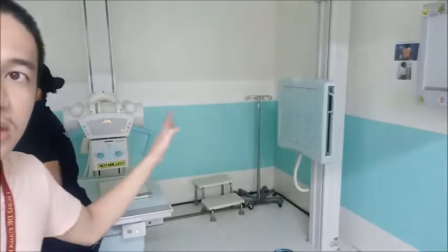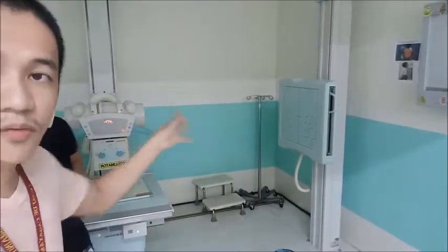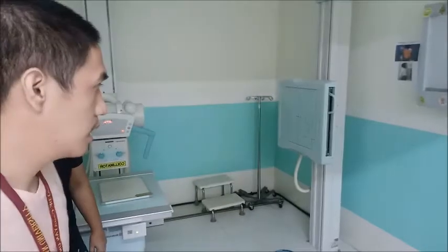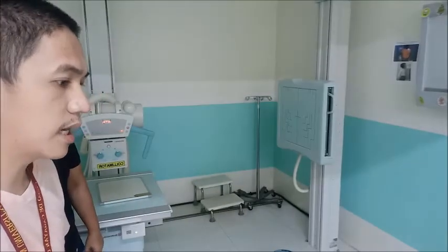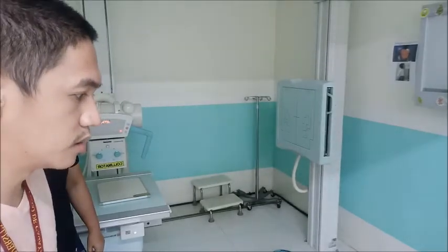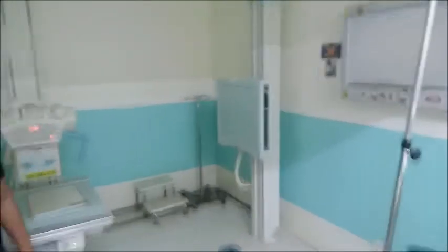The difference is based on the position: the patient is lateral, facing the IR. For the lateral in a wheelchair, it is difficult because of the railings. But if upright, then it is easy.